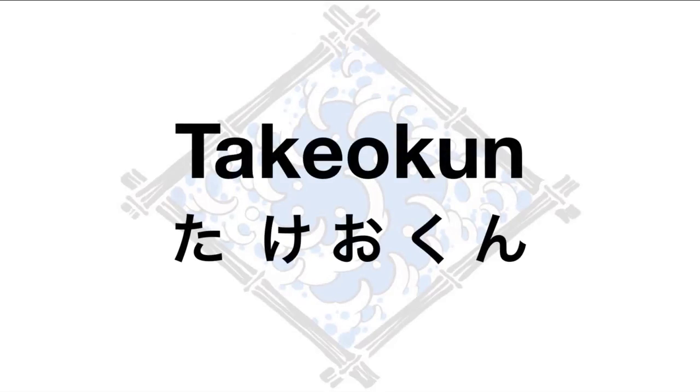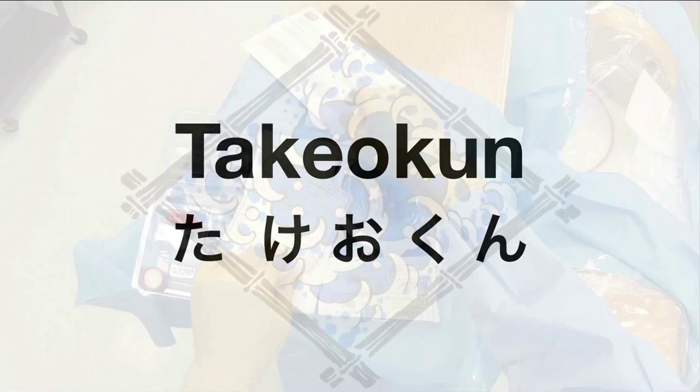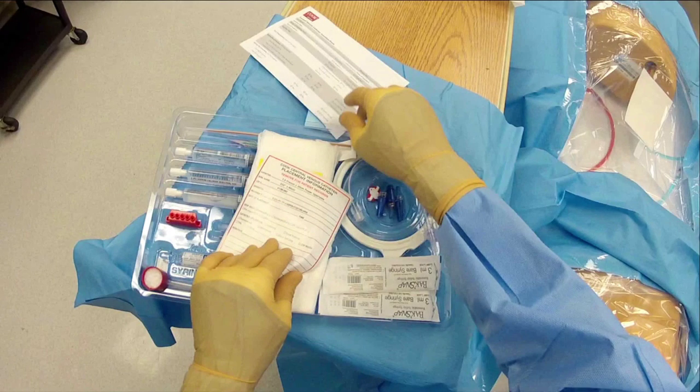This is a short video about placing a central line, focusing on the operator's point of view to go through the kit and all its parts. Kits can be different from institution to institution, so there may be some variability in the equipment you use. We've opened the kit and have sterile process in place. This demonstration will focus more on the kit and its parts rather than full sterile technique or the central line placement itself.